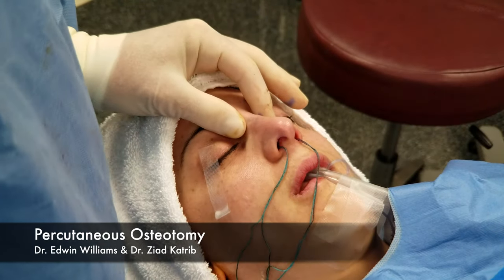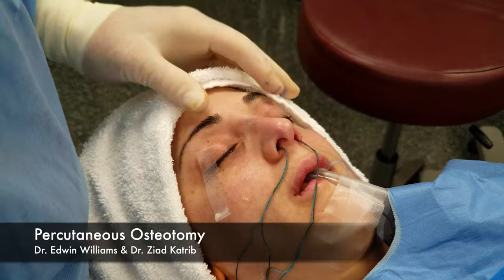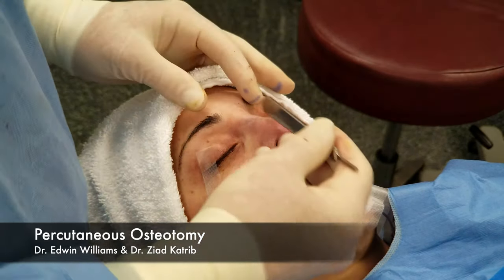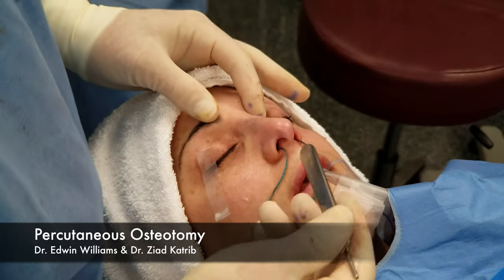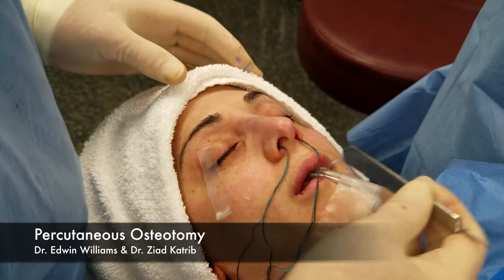One of the most challenging things to do is to get a nose perfectly straight. This patient had previous rhinoplasty — her nose was very deviated. We straightened out the septum, put a little on the dorsum, and then performed our medial and lateral osteotomies.